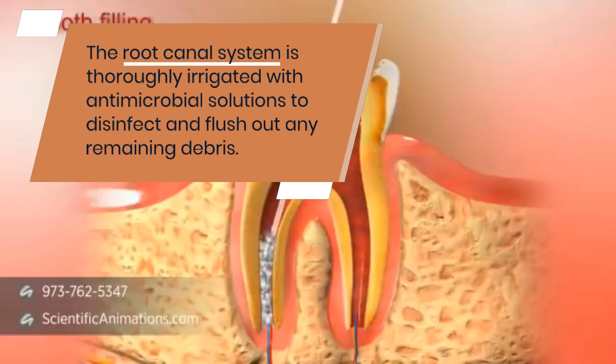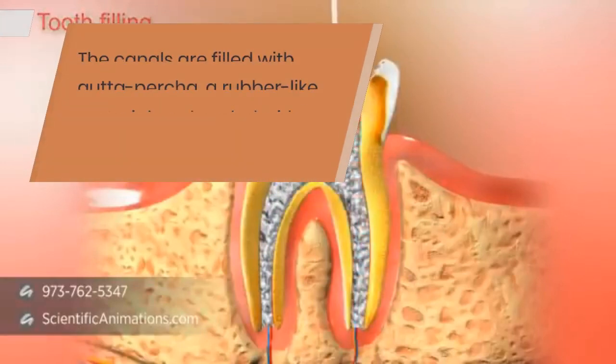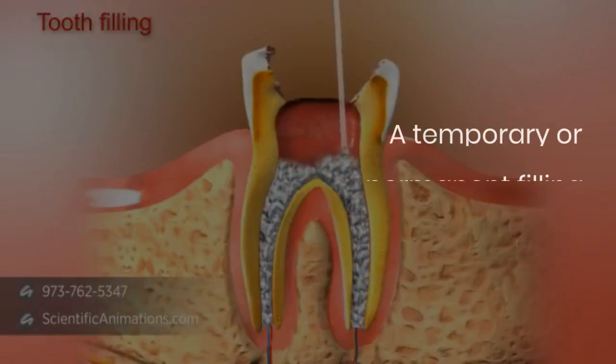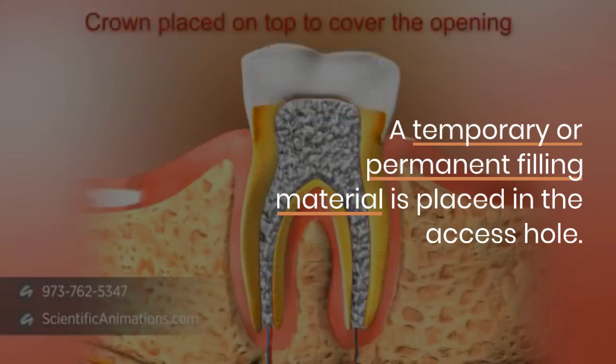Irrigation. The root canal system is thoroughly irrigated with antimicrobial solutions to disinfect and flush out any remaining debris. Filling. After the canals are cleaned and shaped, they are filled with a rubber-like material called gutta percha. Gutta percha, combined with an adhesive cement, seals the canals to prevent reinfection.